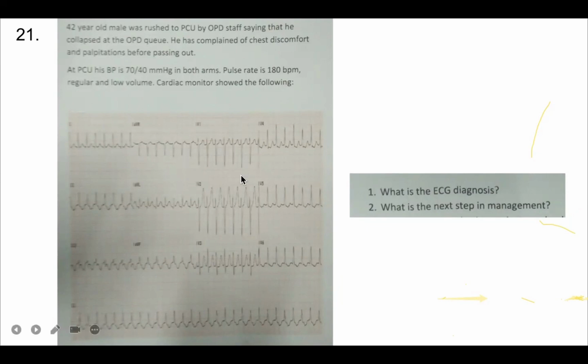So at this moment, the accessory pathway is conducting from ventricle to atrium to complete the circuit. That is why we call it orthodromic. We are referring to the conduction of the AV node. So in the antidromic one, why is it broad? Because the AV node conducts retrogradely, and the ventricle gets depolarized in another way, not from the normal conduction system. So the QRS will be broad, right?